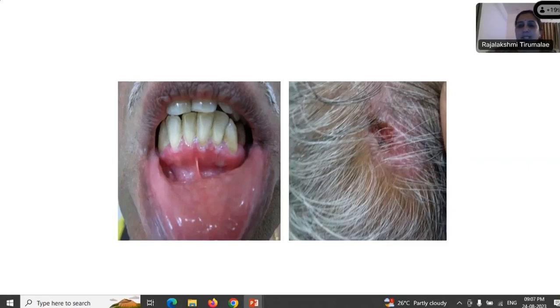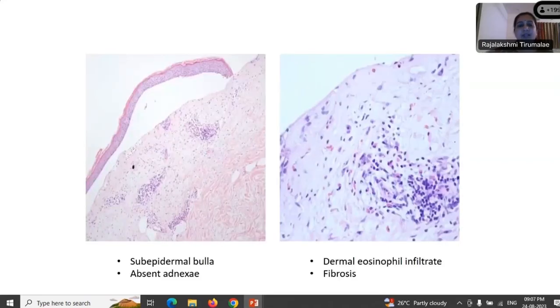This biopsy came to us with a diagnosis of LE. So they thought it was a DLE. And this is what we received. So what are we seeing here? You see a subepidermal blister, right? But what is the difference between what you saw in the earlier case and this one? Do you see any contents? You don't see anything here, isn't it? It looks cell poor, right? There are a few eosinophils in the infiltrate.